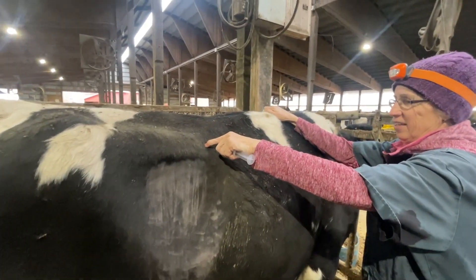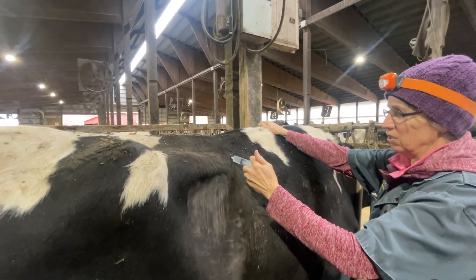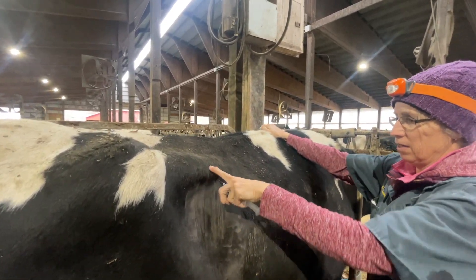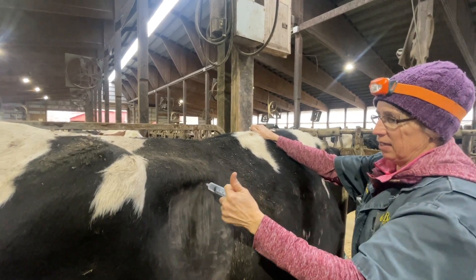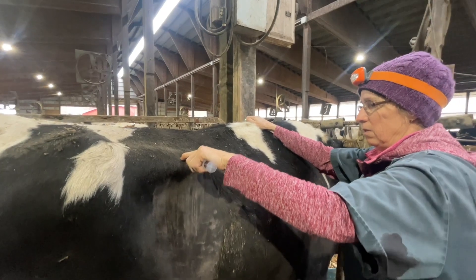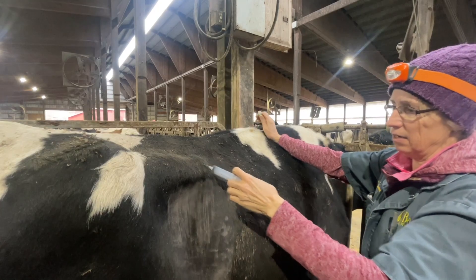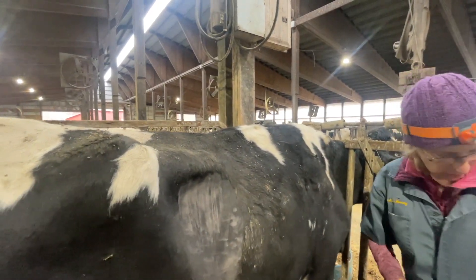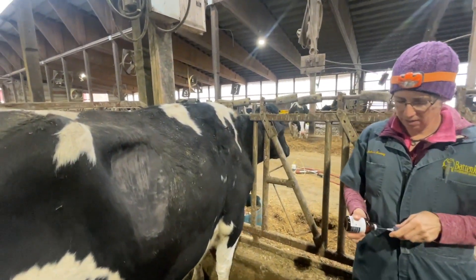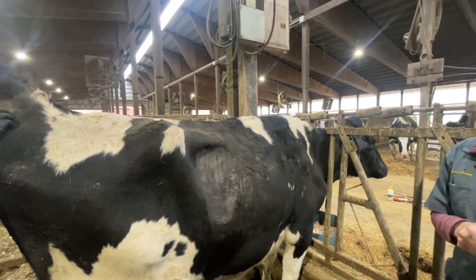So what shot are we giving her now? This is the lidocaine, so she won't feel the incision and the surgery through the skin and the muscle — just like when a person gets surgery and they get anesthesia. This is a local anesthesia for the cow. We also gave her a general sedative — that's what we saw Dr. Murray putting in at the tail head, underneath the tail. So that relaxes her, makes her a little more chill — giving her a chill pill.